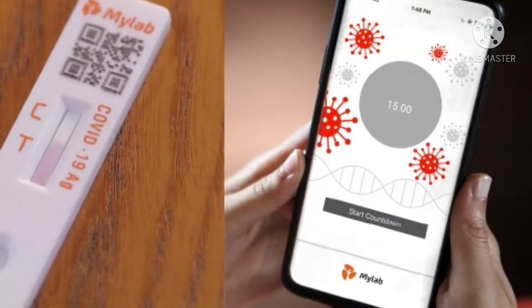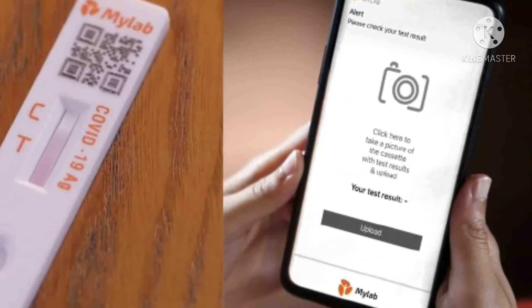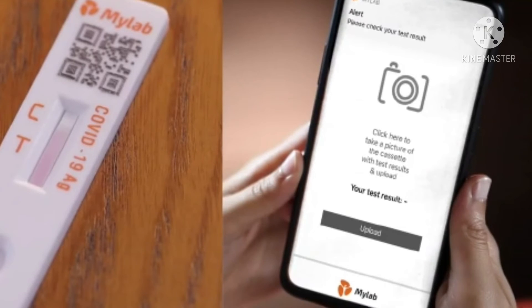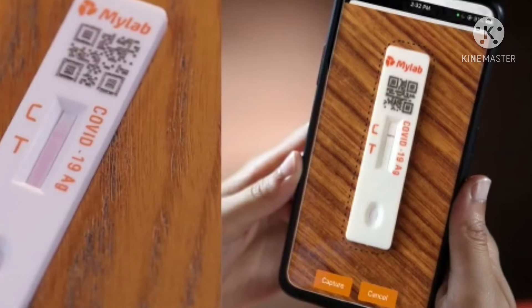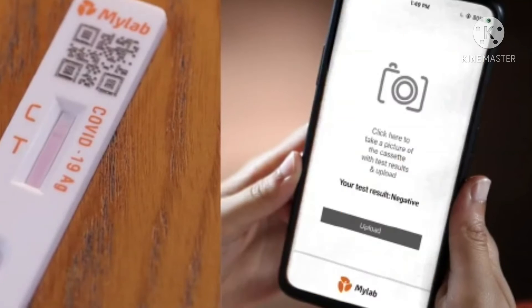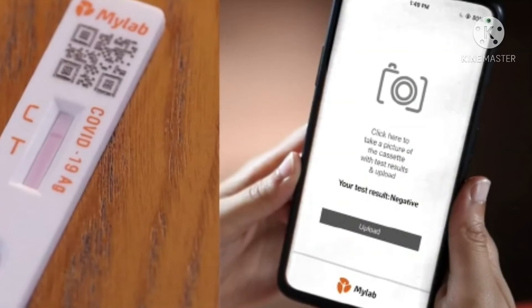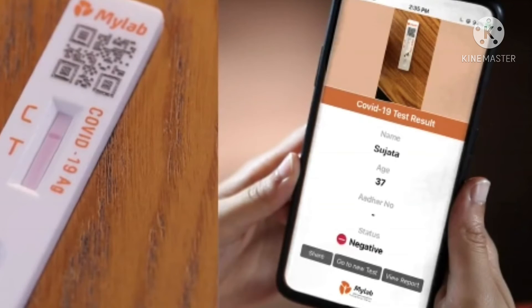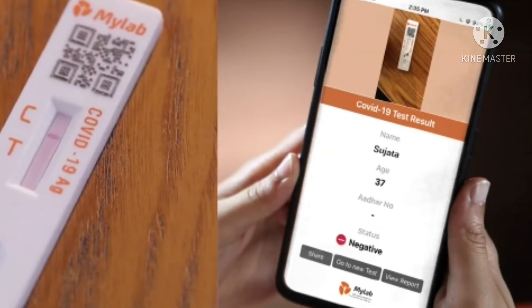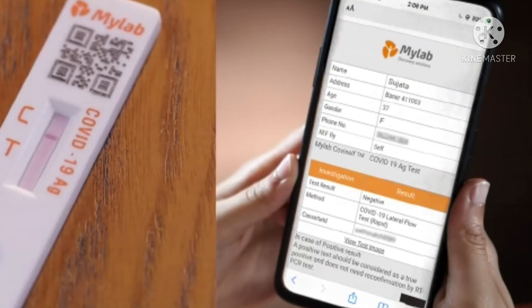After adding 3 drops, we will wait for 15 to 20 minutes for the test results. If you have one control line, it will be negative. If you have two lines — a control line and a test line — it will be positive.